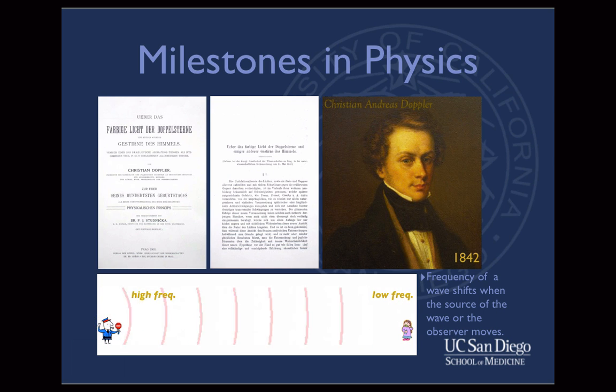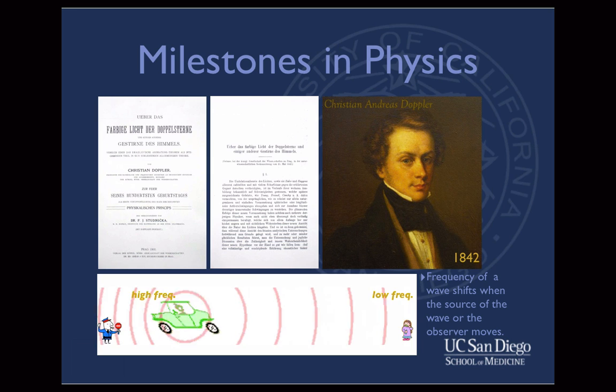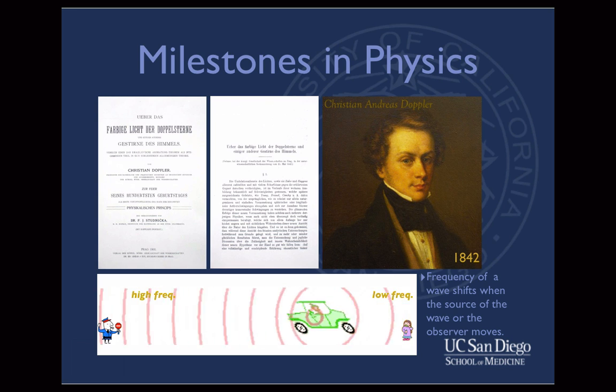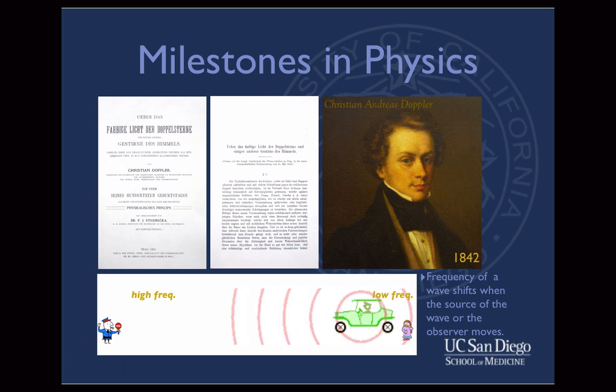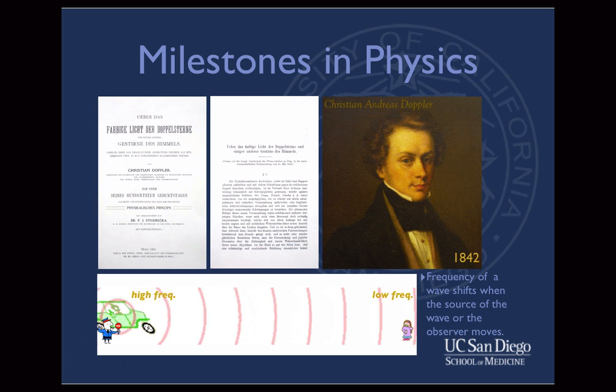In 1842, Christian Doppler published and presented his work on the color of the stars. He hypothesized that the frequency of a light wave actually shifts when the source of the wave or the observer moves. The same is true for sound waves. This principle was later named the Doppler effect and is illustrated in the video clip at the bottom of the screen. The car emits a sound wave.